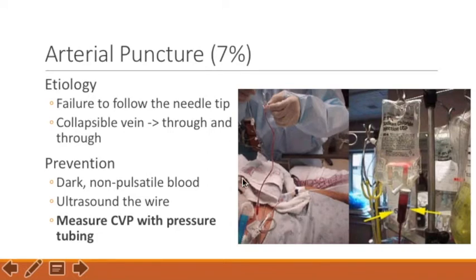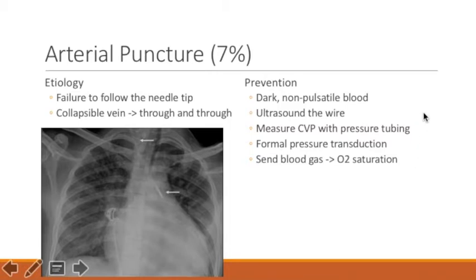If you have arterial puncture, the blood will fill and rise up and up and up and usually squirt out the top of your IV tubing. This pressure is not the central venous pressure, this is an arterial cannulation. If the blood column does rise up a little bit and stops after 5 or 10 centimeters, that's probably central venous pressure. The patient's just volume overloaded due to CHF or renal failure. If the blood continues up the column and falls out the top of your tubing, that's for sure arterial puncture. And if you don't notice it and try to bolus somebody's saline, that blood will rise right up into your saline bag as well. Very rarely, if these 3 steps should almost always confirm venous puncture.